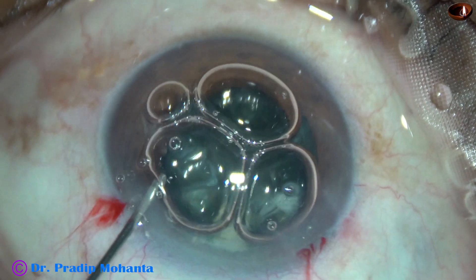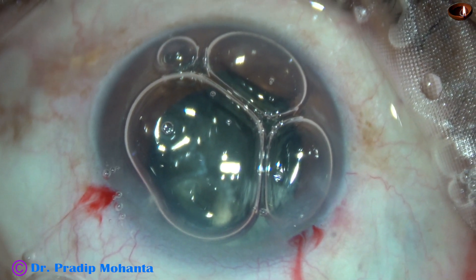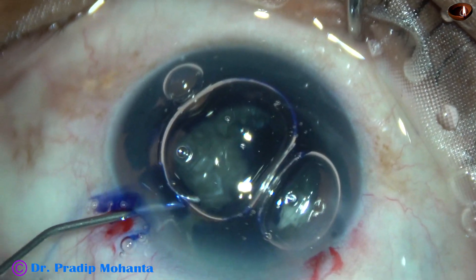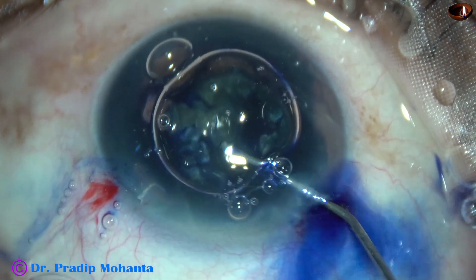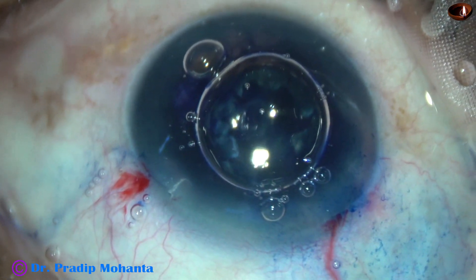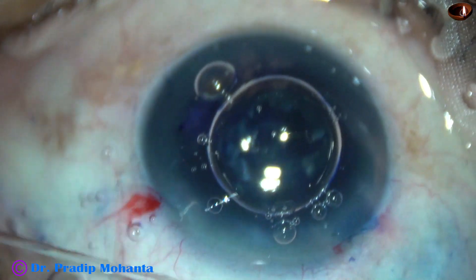So at this time, I want to put a CTR because it is going to take some time to get the vitrectomy setup ready. So by this time, I am going to stain the anterior capsular rim and place the capsular tension ring.